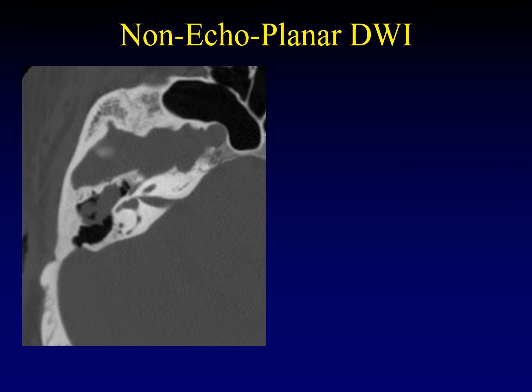When we talk about cholesteatoma, the topic of diffusion-weighted image always comes up. To understand why diffusion-weighted image is so important in acquired cholesteatoma, you have to go back to what we used to do surgically before we used diffusion-weighted imaging. Cholesteatomas had such a high recurrence rate that patients would routinely undergo a second surgery several months after the resection to look for that recurrence and take out the recurrent disease. We call those second look surgeries. And it was routine. Every single cholesteatoma patient got one.